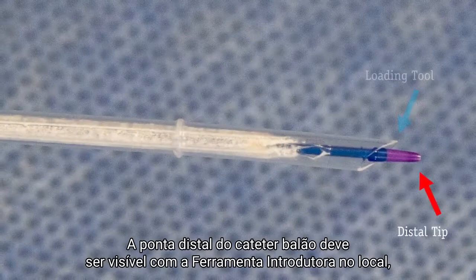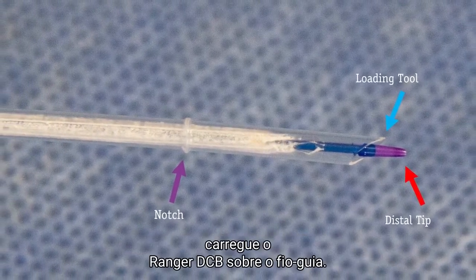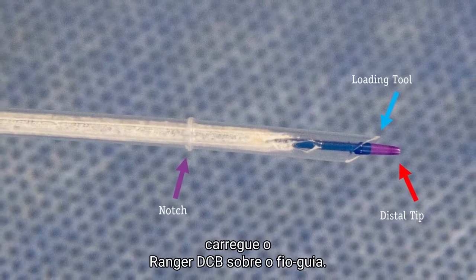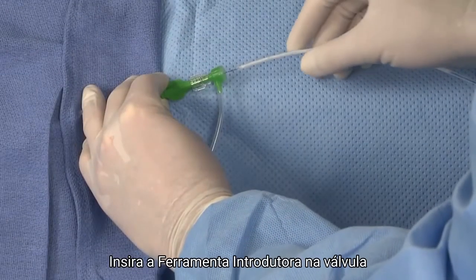The distal tip of the balloon catheter should be visible with the loading tool in place. Backload the Ranger DCB on the guide wire. Insert the loading tool into the valve.